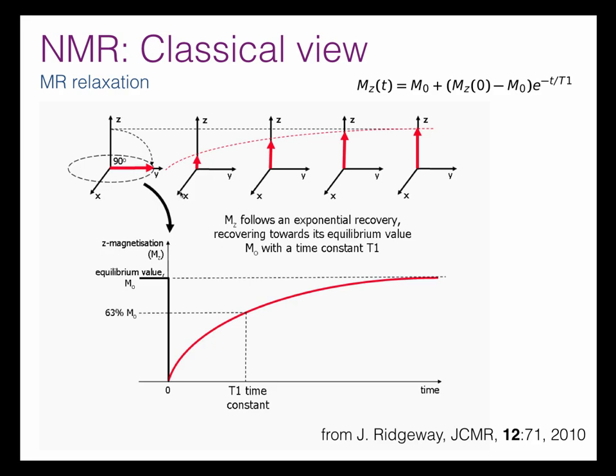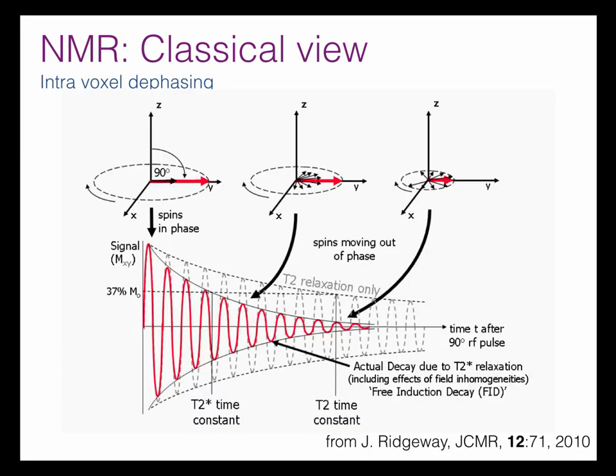Okay. So in addition to the T2 relaxation mechanism, in any given voxel we're likely to have a slightly inhomogeneous field. This means that even if ideally the signal would have decayed like this T2 relaxation curve, in practice the magnetization in the voxel is experiencing slightly different background fields, and it turns out the magnetization gets out of phase rather quicker than that, so it actually decays in practice at a rate called T2 star.